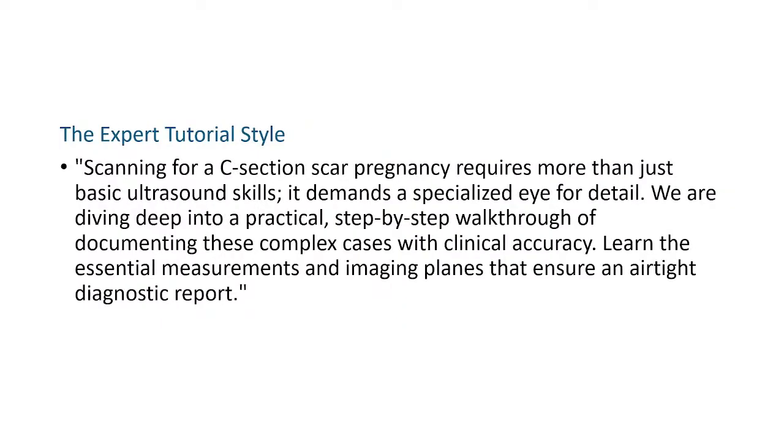So the expert tutorial style: scanning for cesarean scar pregnancy requires more than just basic ultrasound skills. It demands a specialized eye for detail.